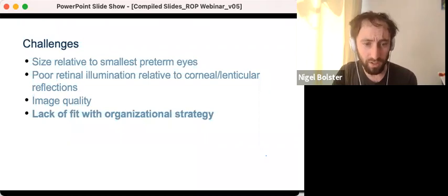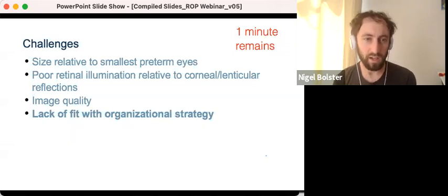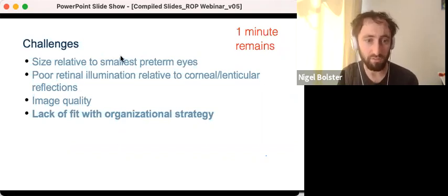All these challenges ultimately combined in producing an image quality which we feel can be improved upon. Image quality is the challenge for a low-cost ROP camera. A further design iteration may very well show that sufficient image quality can be achieved for such a low-cost device. Either way, we hope that Peak ROP represents a challenge to the industry regarding what can actually be achieved using low-cost components.